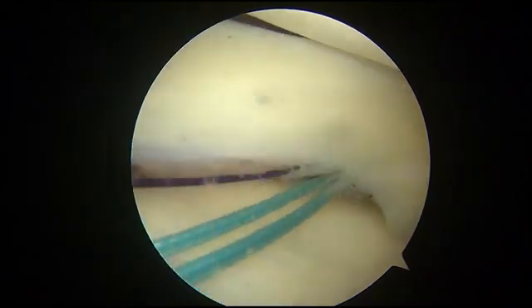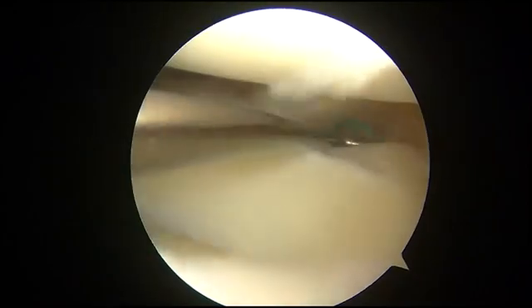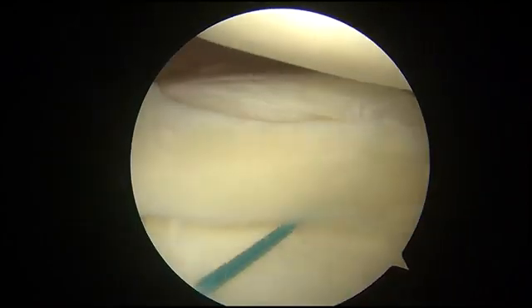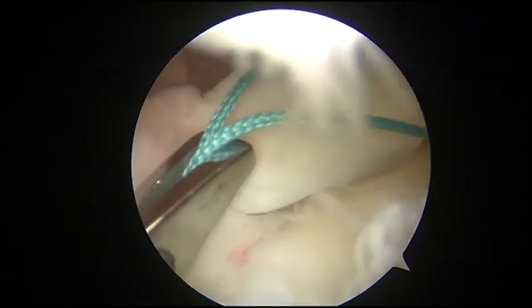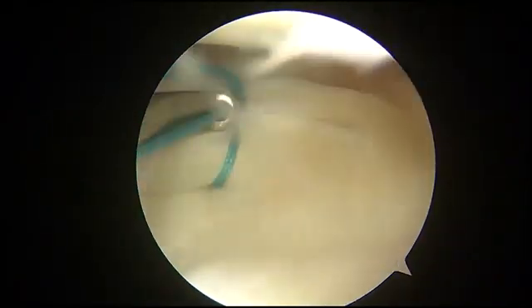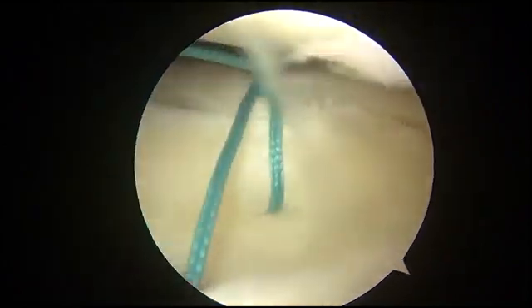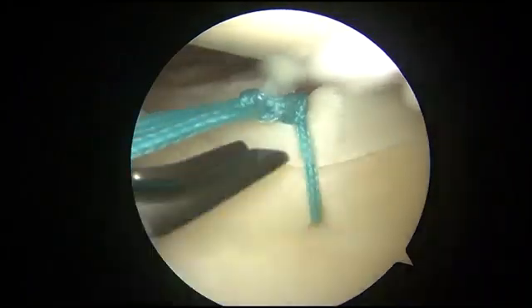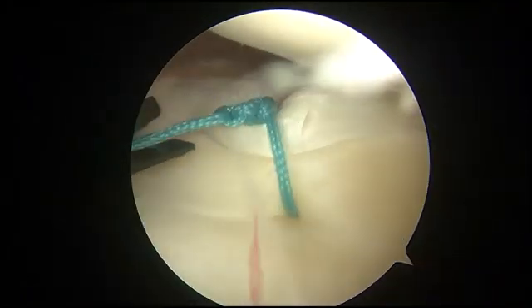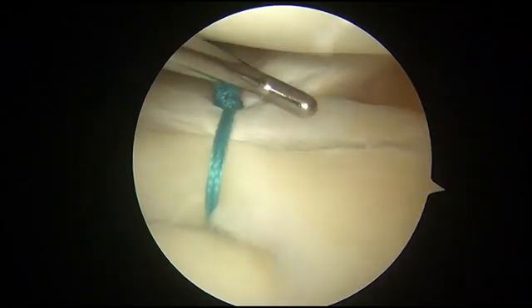A braided suture is replaced in the joint from the anterior medial portal. Then the limb across the meniscus is picked back above the meniscus, with the suture encircling the meniscus. A sliding knot is applied followed by several half knots. The knot is placed at a non-weight bearing area to avoid cartilage damage. The stitch is repeated every 5–10 mm as needed.